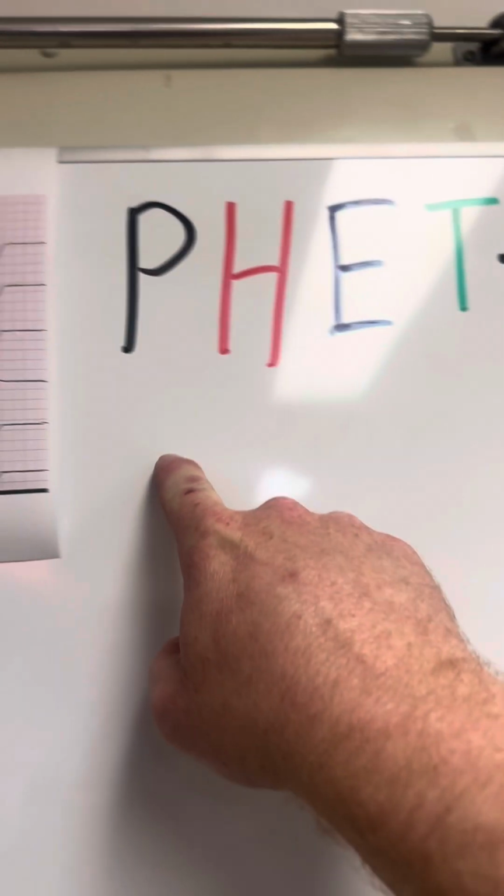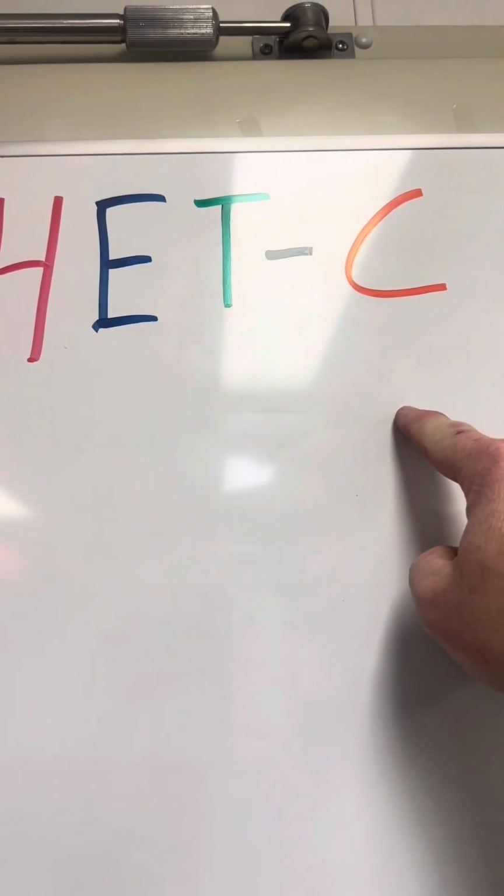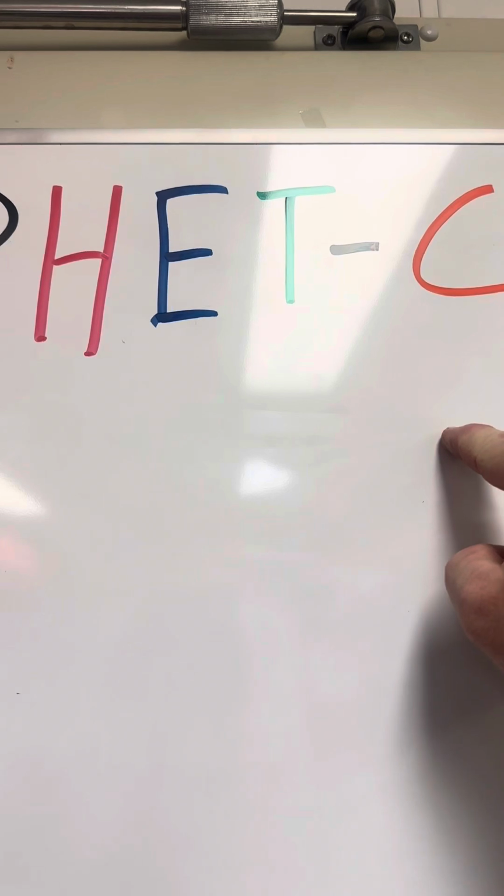And changes brings you back to the beginning. Any changes in the condition that don't support the direction we were going makes us reevaluate. This is a circular order of operations, but it needs to be done in this way. Let me tell you why. If you look straight at this EKG, your brain's gonna go straight into cardiac mode. The best way to illustrate why you shouldn't is to tell you about this patient using the PHET-C model.